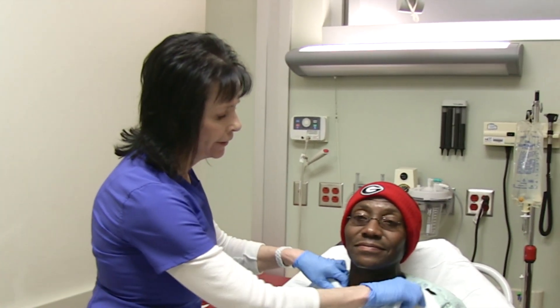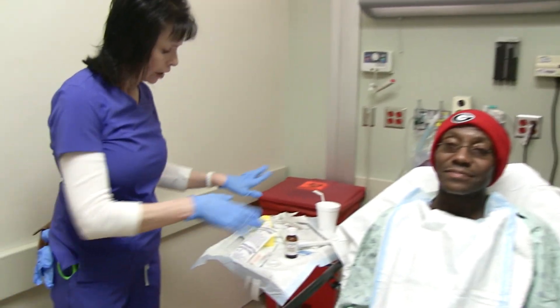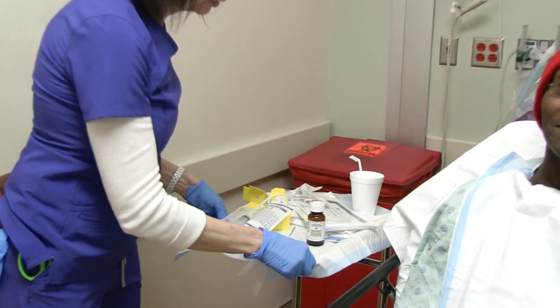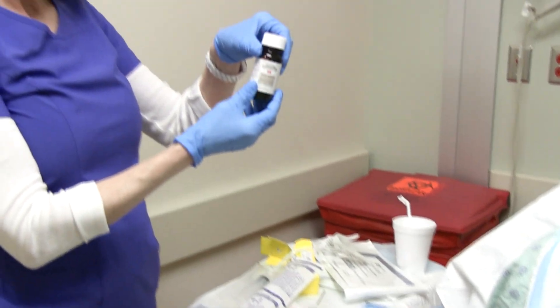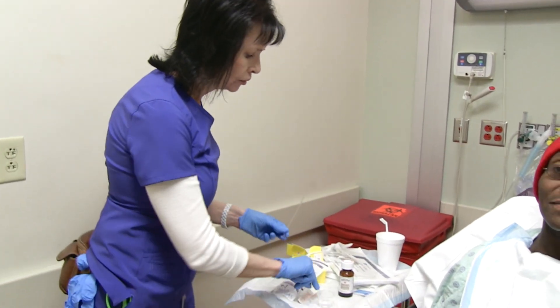This is my very willing patient. We have all the supplies over here. We're going to numb him up first with 4% lidocaine, and we'll be using an atomizer.